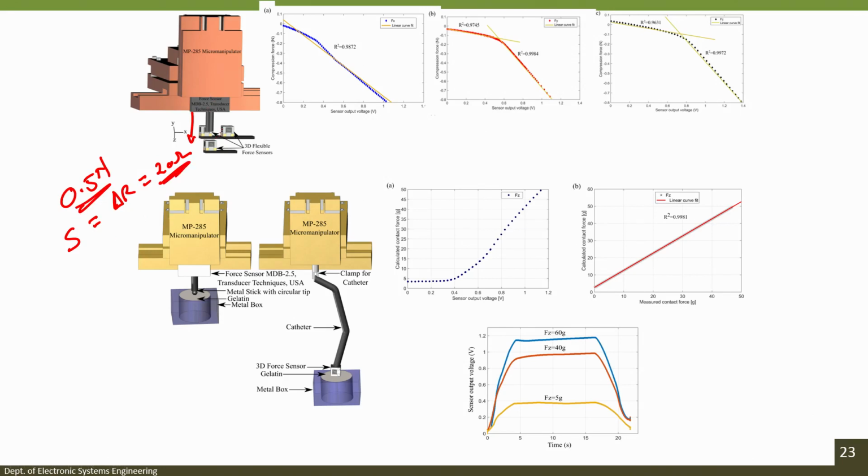Once I have the data, this is what is shown here, right. If I connect the sensor to a proper electronic conditioning circuit, I will show it to you in the next module. Then you can see the change on applying a compression force from minus 0.8 to 0.1 Newton, what we will have is a different sensor output voltage.